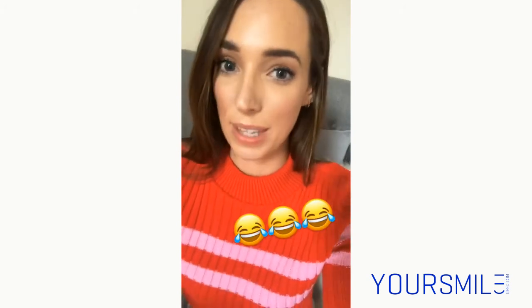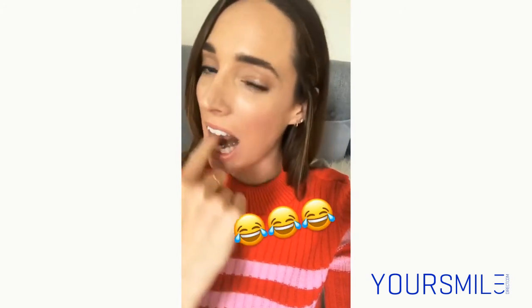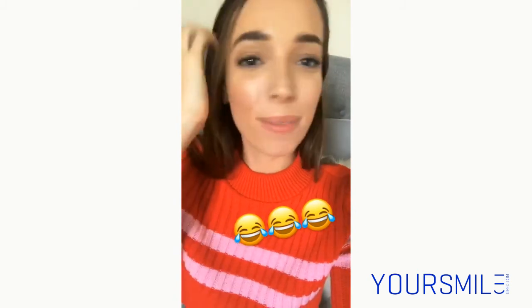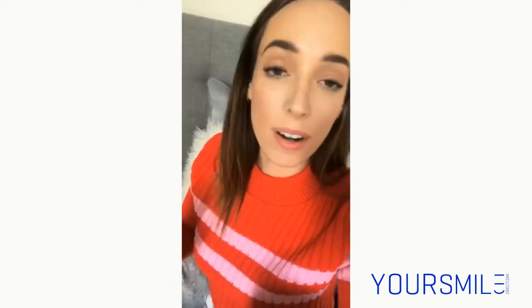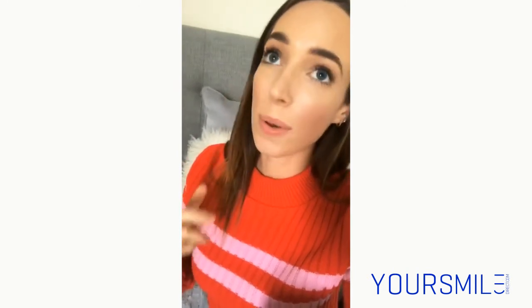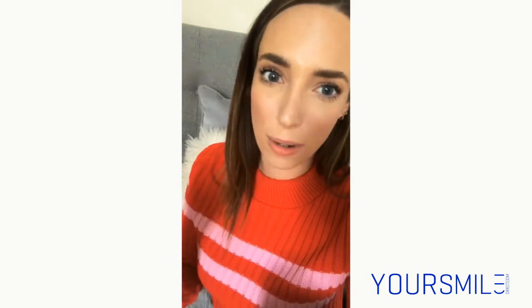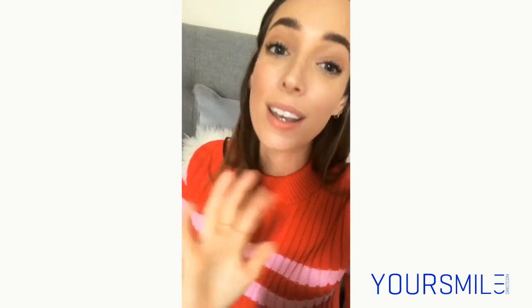So I'm going to put it in. This might be weird. Okay. Did you hear that? They're in! Can you see them? They're not very noticeable, but you can probably hear I have a slight lisp. That's supposed to go away after like 2 days, because if you think about it, you're putting a new thing in your mouth, and your mouth has to figure out how your speech works around it. So don't be worried about it.